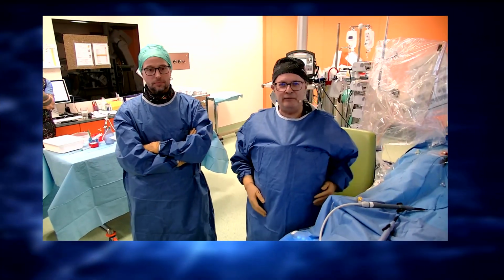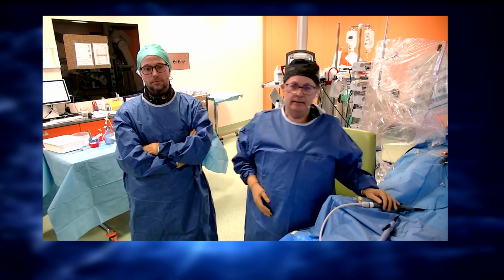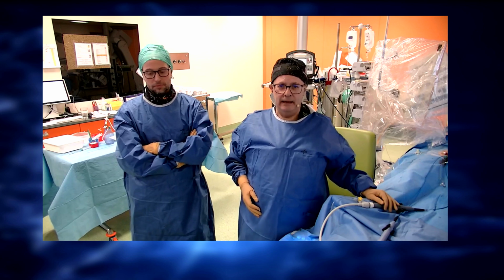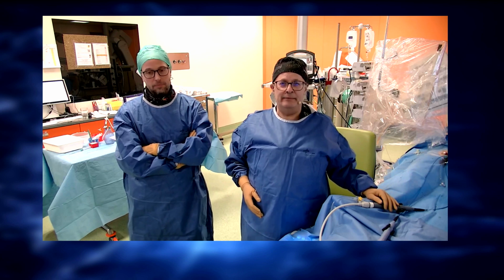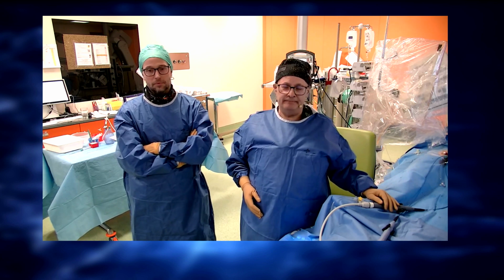Good morning to everybody. Today we have a very interesting case. Very young patient with several cardiac arrests. Apparently nothing abnormal, unless the presence of early repolarization at the EKG.